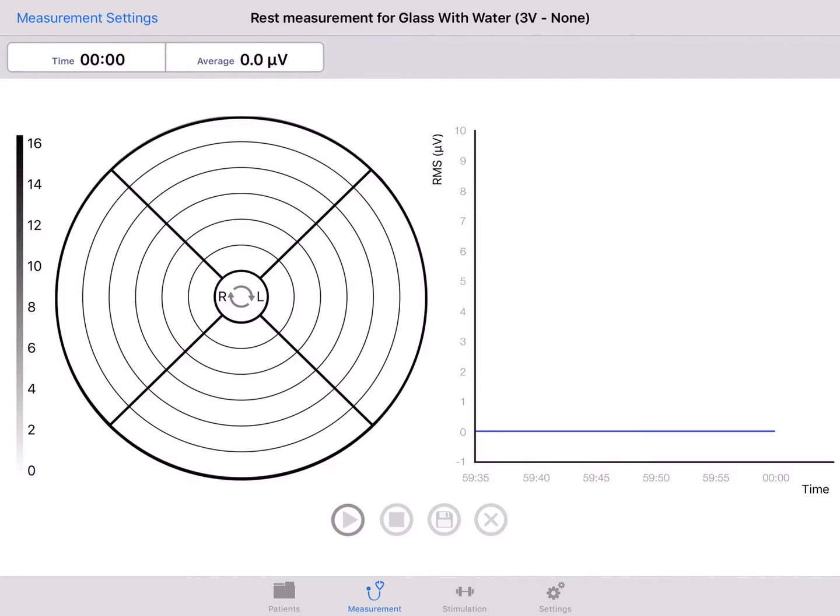On the right, a line graph is displayed. This line graph shows you the average EMG of selected electrodes in microvolts. Above the grid and line graph, you see the time and also the average EMG of the selected electrodes in microvolts.